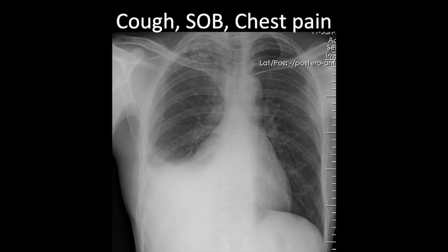So those are examples of mediastinal masses. Let's look at this one now. When you look at this film, there's a clear abnormality on the right side. You can see soft tissue density which obscures the right hemidiaphragm. It has a meniscus configuration here — this is a right pleural effusion.